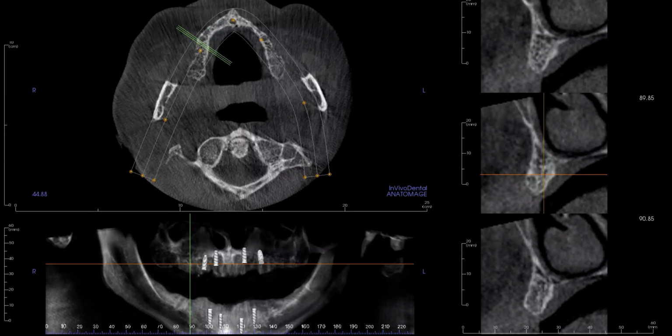Now, there are cases where you don't need to do that. We still call it the all-on-4, but just know historically the all-on-4 concept, as developed by Paolo Malo, was designed to be a graftless solution with tilted implants. But all of the concepts that came out of that work apply here. We just place implants where we can.